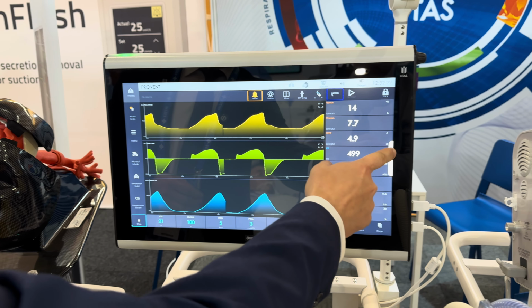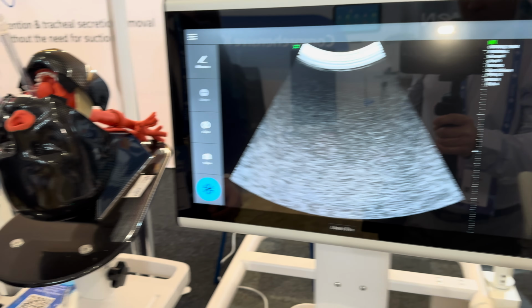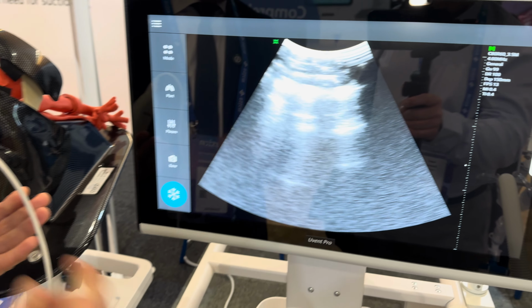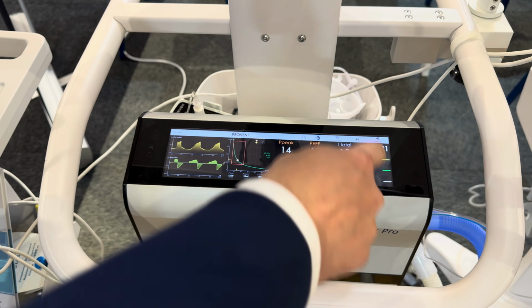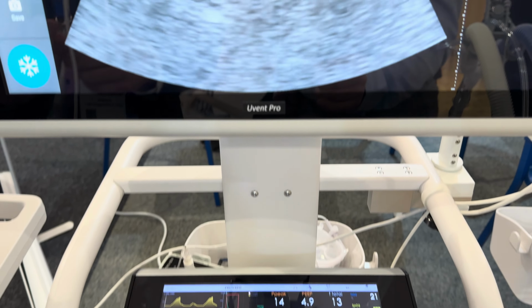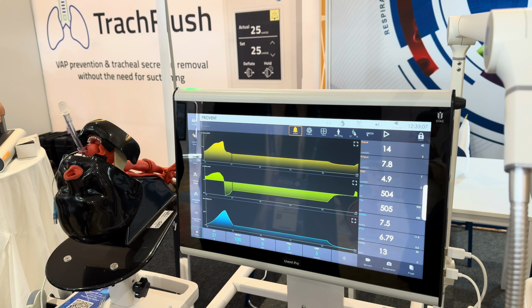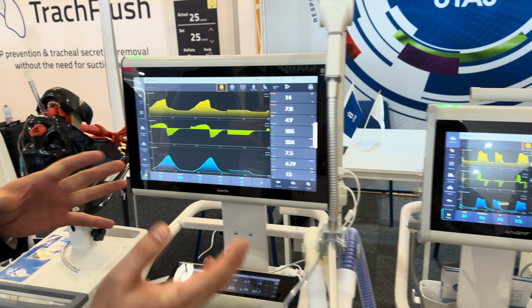The other possibility we have in this ventilator is to provide point of care ultrasound, using the USB probe to perform the point of care ultrasound for a patient. Therefore, we have a dual screen system, because while you're dealing with POCUS, point of care ultrasound, you also need data about the respiratory parameters and the status of the ventilation. As soon as you finish the examination, you go back to the ventilation process. All the other parameters regarding these devices are almost the same.